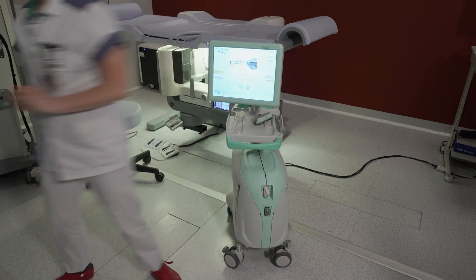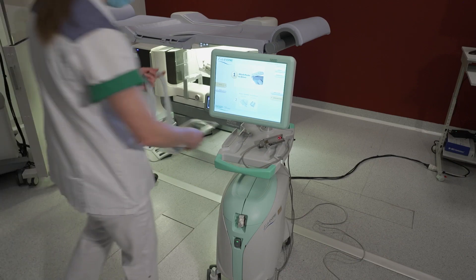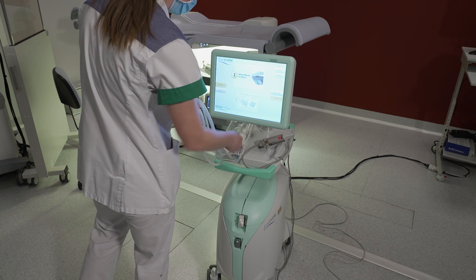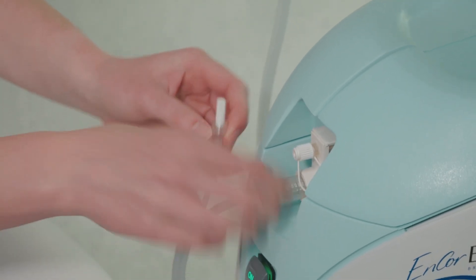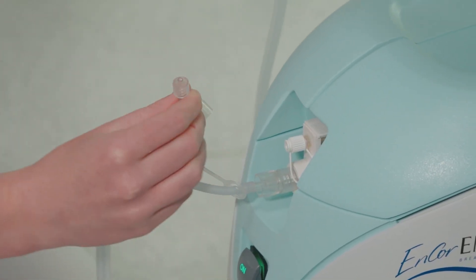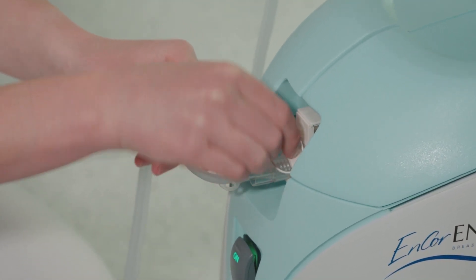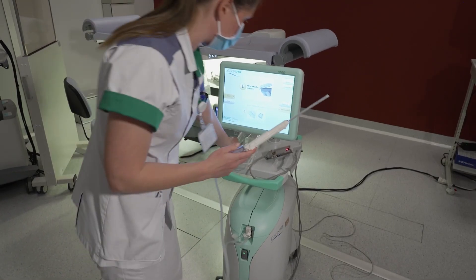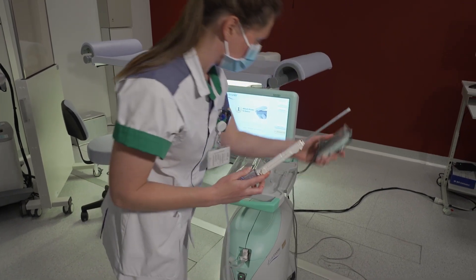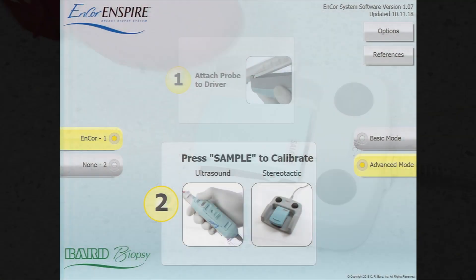The INSPIRE system is ready to install the ENCORE probe. The ENCORE 10G probe tubing is connected to the cassette, fluids, and saline connectors. The ENCORE probe is attached to the driver and calibration starts with pressing the foot pedal. The ENCORE INSPIRE touchscreen is ready in a few seconds.